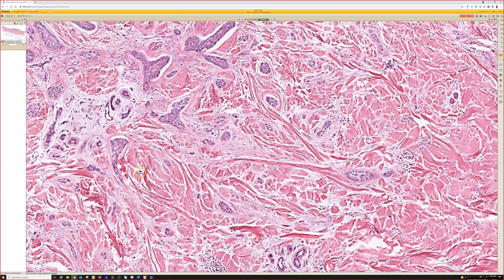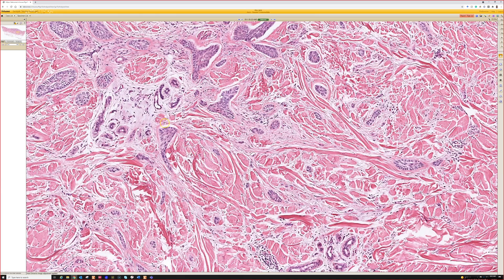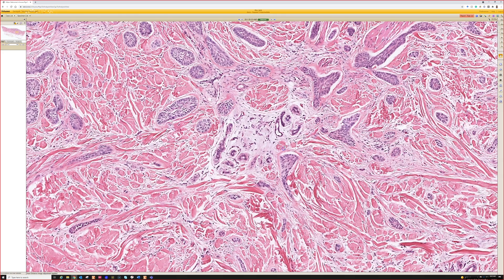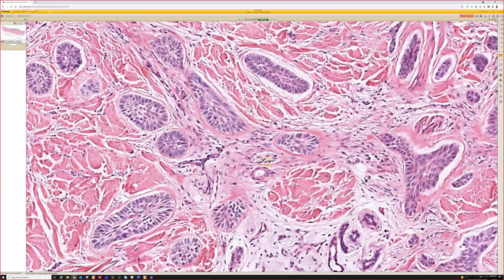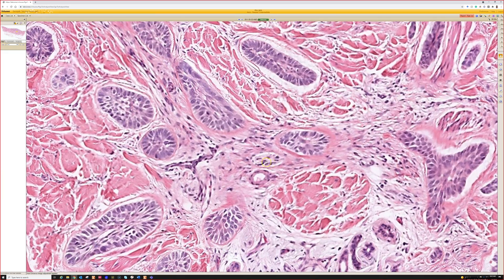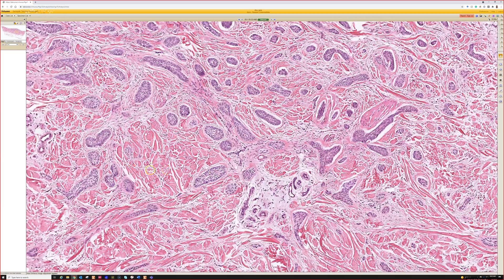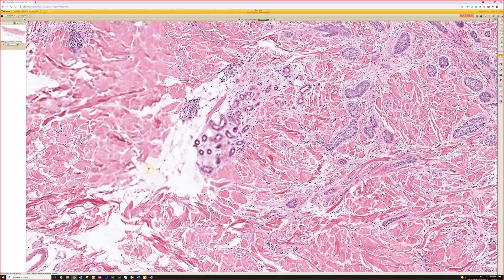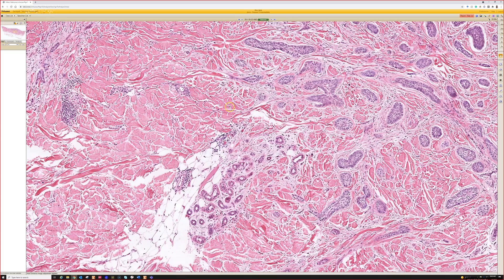When I see tumor — nascent basal going way out in certain areas — the next thing I do is look for perineural invasion. I saw this and thought there's probably perineural involvement. And look, here's a nerve with tumor very close — not in it, but really close. I did find one over here when I looked last night.